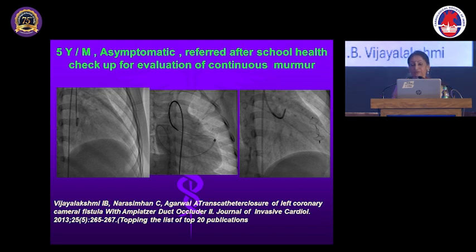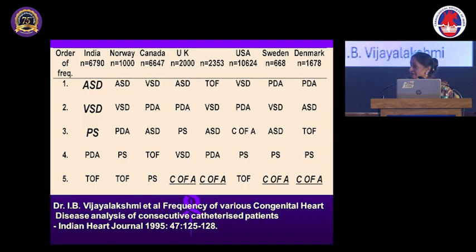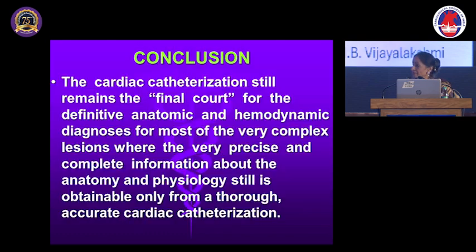Now what is this? Identify the catheter. This is normal. LPA injection shows the normal pulmonary veins draining into LA, LV. Now the same thing I'll do on the right side. What do you see now? Do you see anything? Anyone? Yeah, you are pointing right, but what is it? There is a paracardiac shadow here.